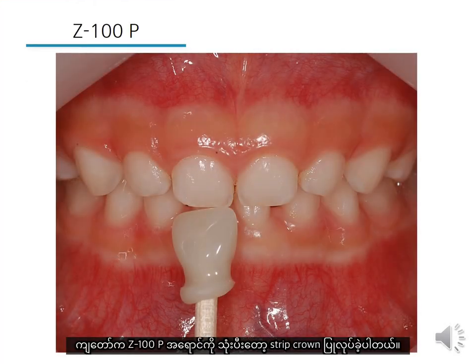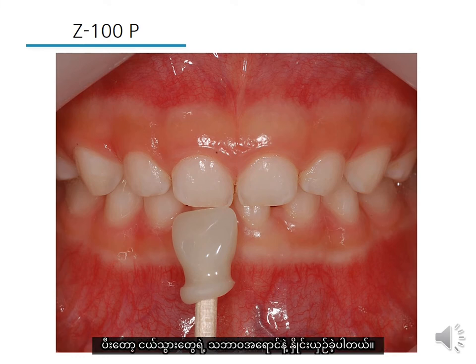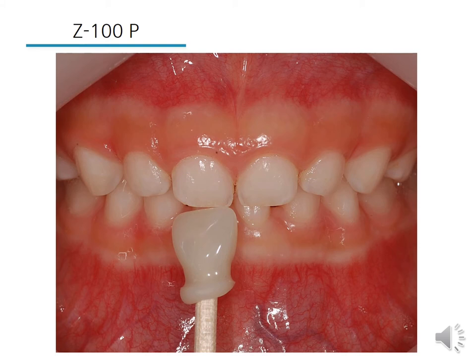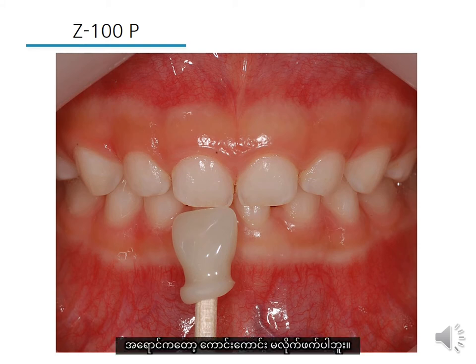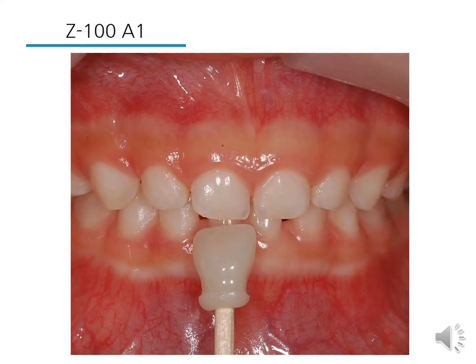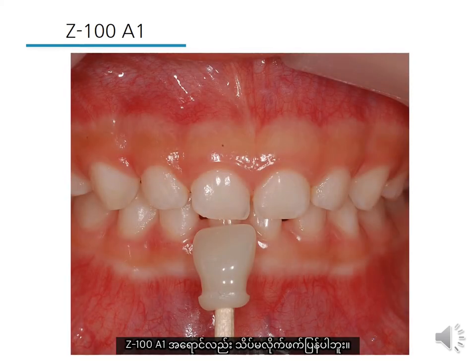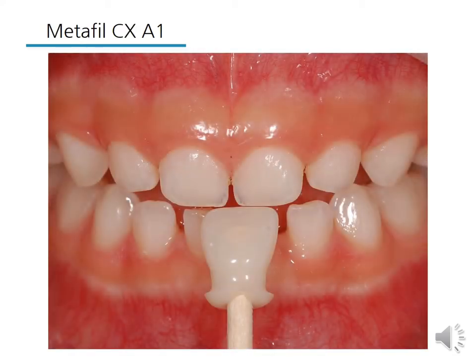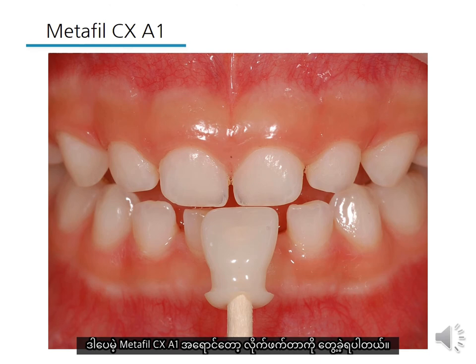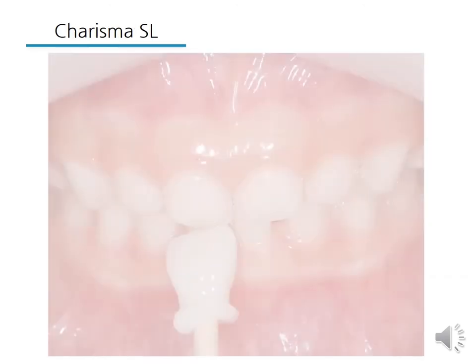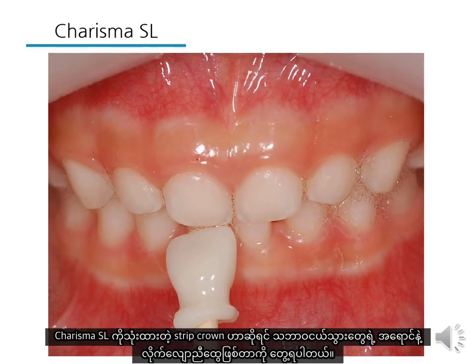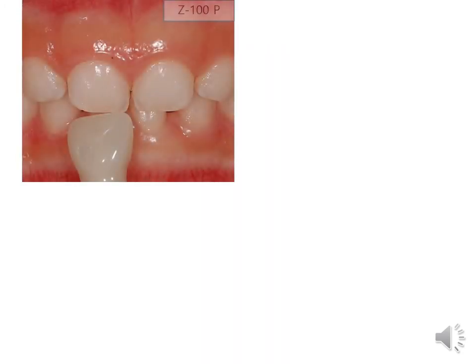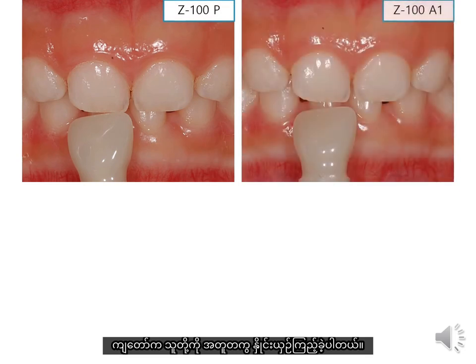I made a strip crown using Z-100 P shade and placed it next to the natural incisor — the colors did not match well. Z-100 A1 shade did not match well either. However, Metafil CX A1 shade matched well. A strip crown using Charisma SL looks harmonious with the natural incisors. I compared them together and you can see the differences.